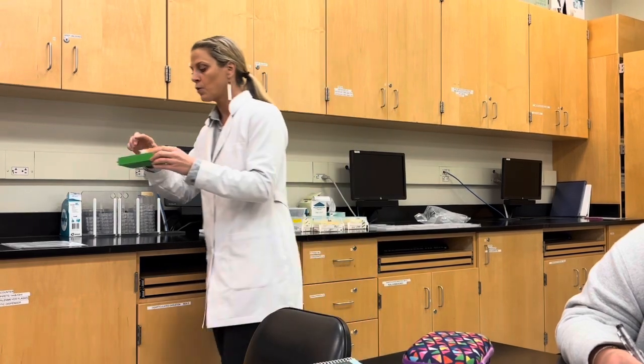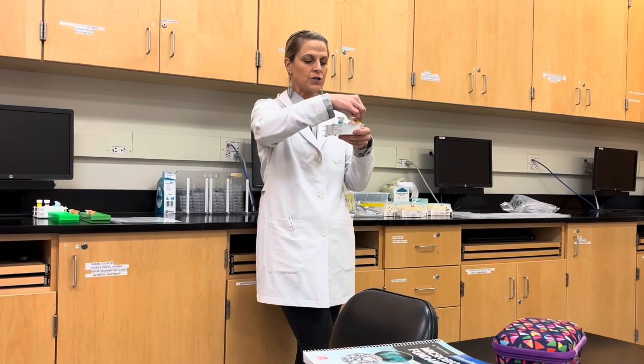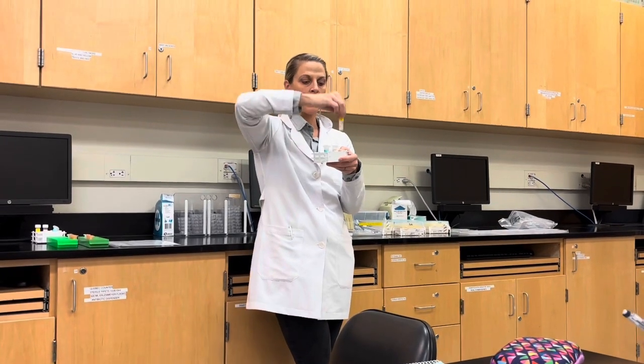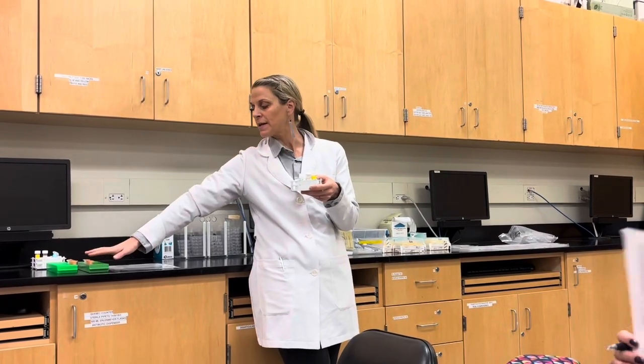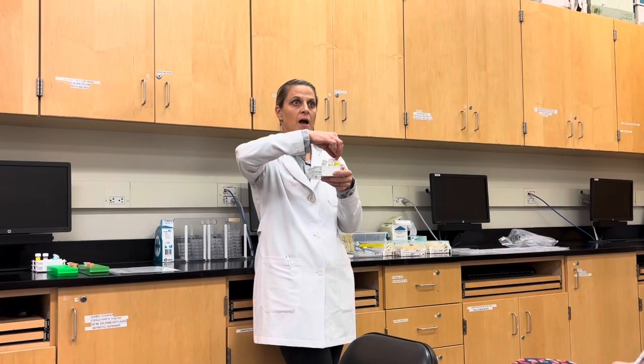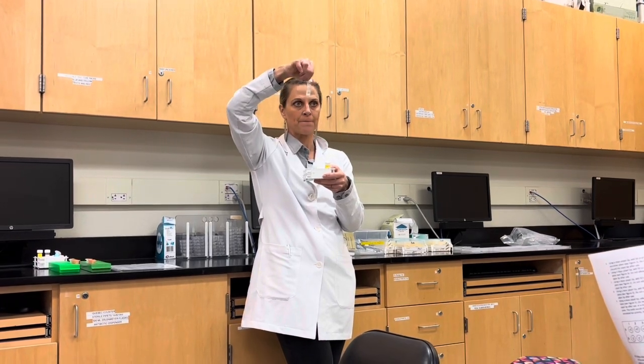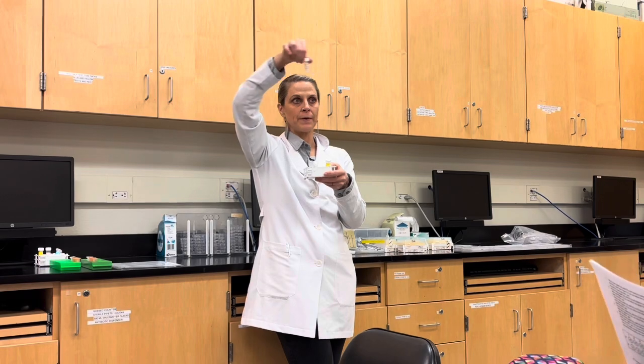So here are your positives, negatives, and then your patients A through F. Here is your primary antibody. So you're doing antigen first. We're adding our antigen, then we're going to add our patient's serum. Do exactly like your book says, but it would make sense to add our patient's antibodies at that point. Hypothetically, we would wash it, but we're not doing that. Then we're going to add our secondary antibody. This is the rabbit antibody that matches the human antibody and has the enzyme already linked to it.